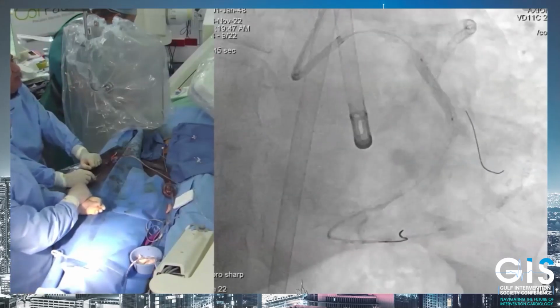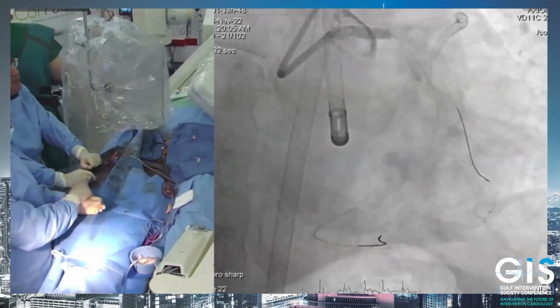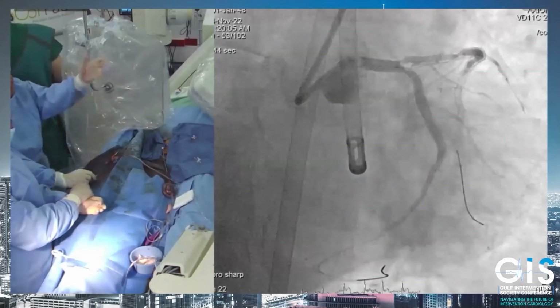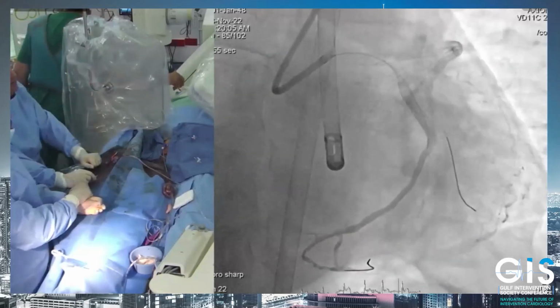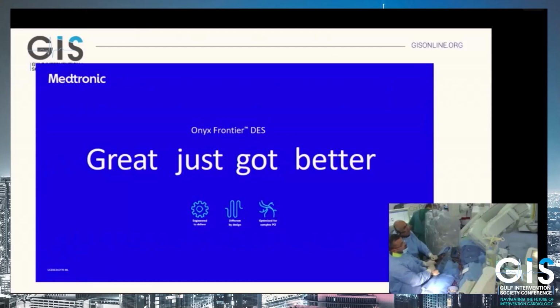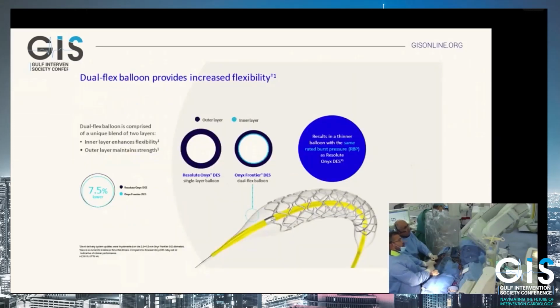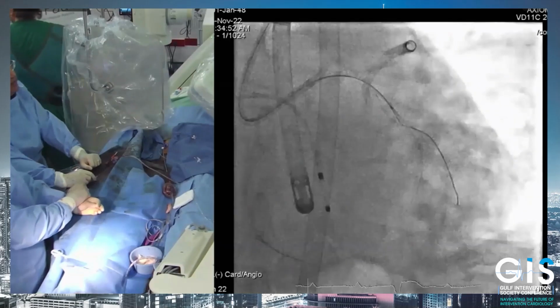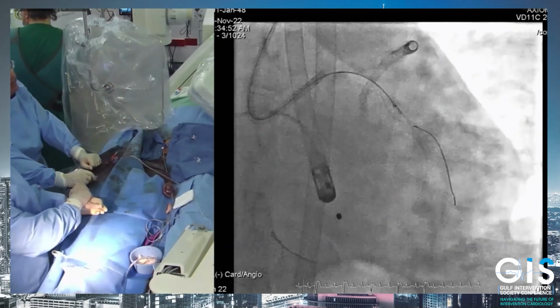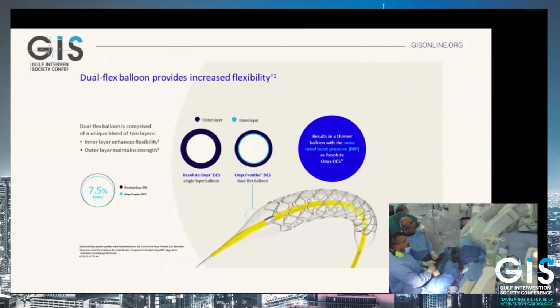It's really a great one, it was deliverable easily, and we will talk about this stent later on. And you can see that the flow got a little bit impaired after all this kind of plaque embolization downstream. And then that OM got closed. So we really had challenges getting access back. We tried once, twice with many wires. And then we thought to go under the struts with one balloon to open up, just to give a little bit of breath to that OM.